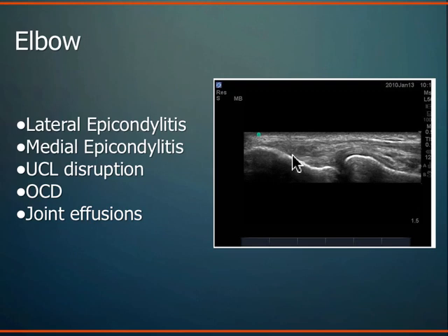So the tennis elbow is really a tendon disorder. And so epicondylitis is a little bit of a misnomer, but what you're dealing with mostly is tendon pathology or tendon abnormalities. And so on tennis elbow, a lot of times you can visualize that tendon quite nicely. And this tendon has this fluid collection here, disruption of normal tendon fibrillar pattern. It's a little bit thicker. So this is a tendinopathy or probably a chronic tennis elbow. And you can see that quite nicely here.